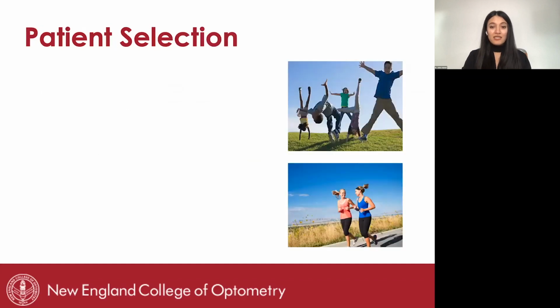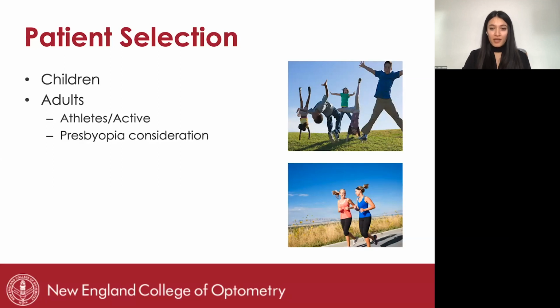All right, so moving on to patient selection. So both children and adults are good candidates for orthokeratology. Like I said, in my clinic, we fit both children and adults. Patients who participate in sports and other physical activities are excellent candidates for Ortho-K.